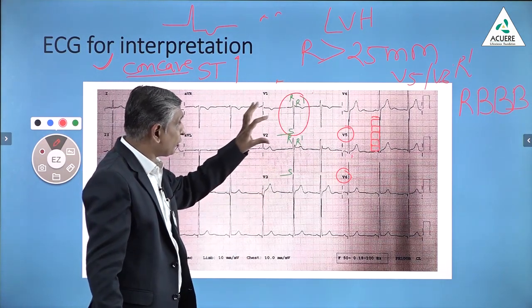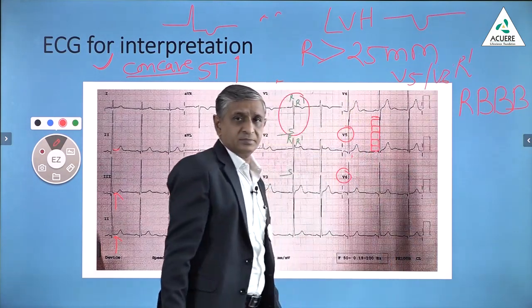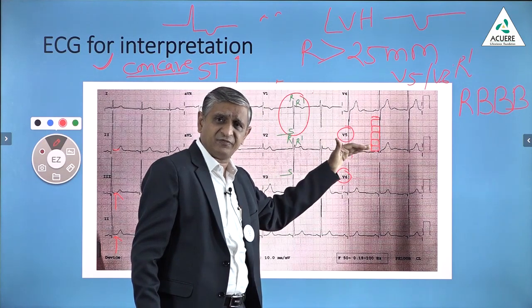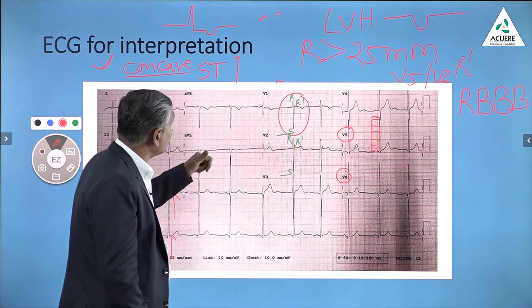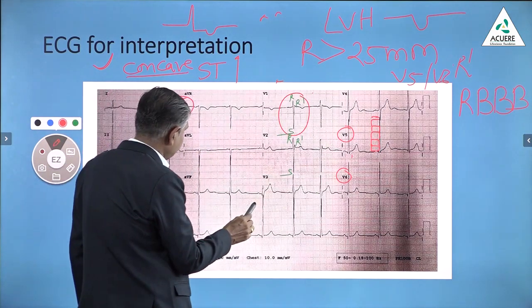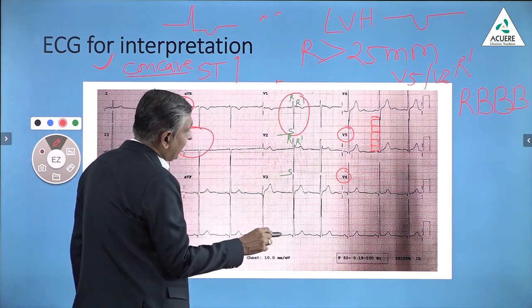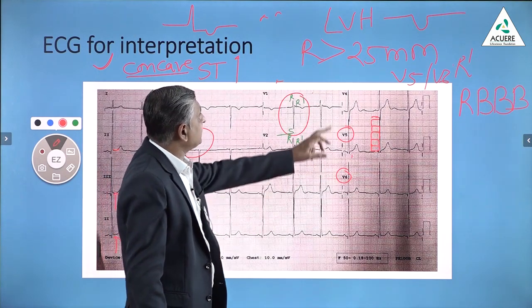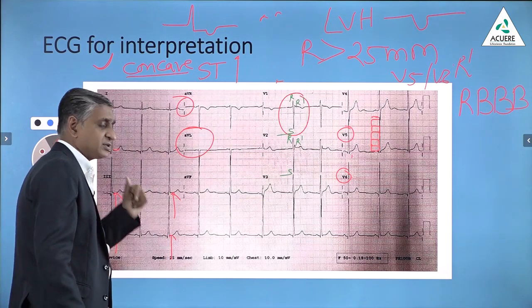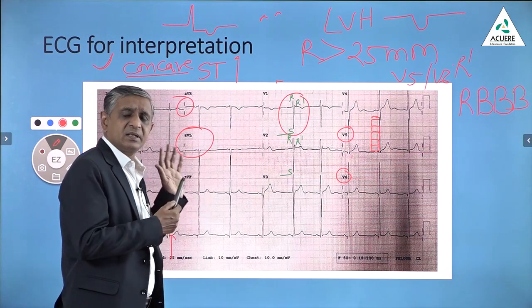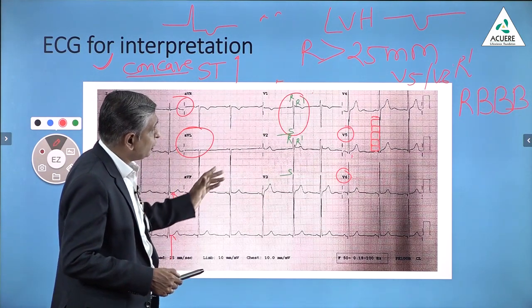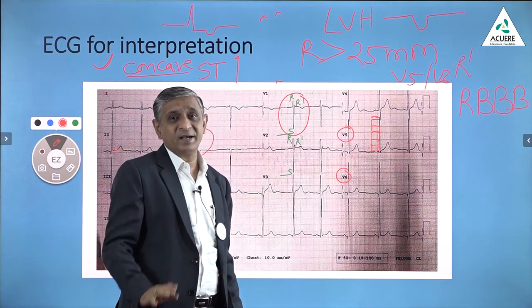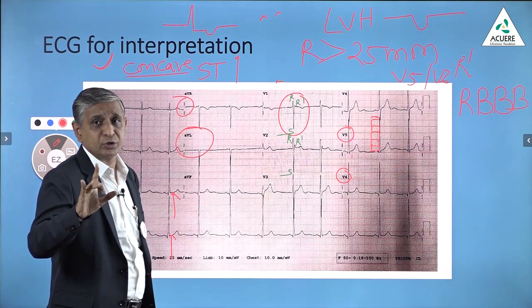But this is very important: the tall R wave should be accompanied by T wave inversion in the lateral leads. The height of the R wave should exceed 25 millimeters in V5 or V6, but it must be accompanied by inverted T waves in lead 1, AVL, V5, and V6. None of these leads are showing inverted T waves. Furthermore, left ventricular hypertrophy is generally associated with left axis deviation, and this ECG is not showing left axis deviation. So this ECG is not showing left ventricular hypertrophy — only higher amplitude R waves in V5 and V6.